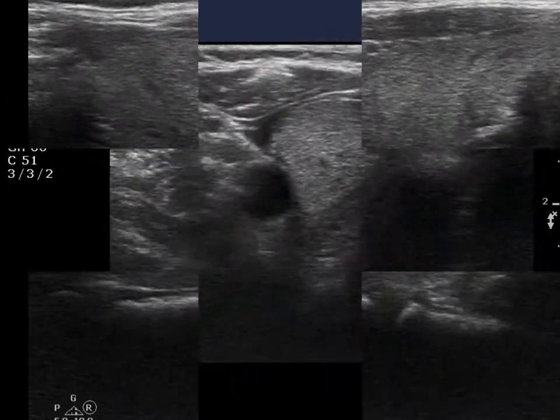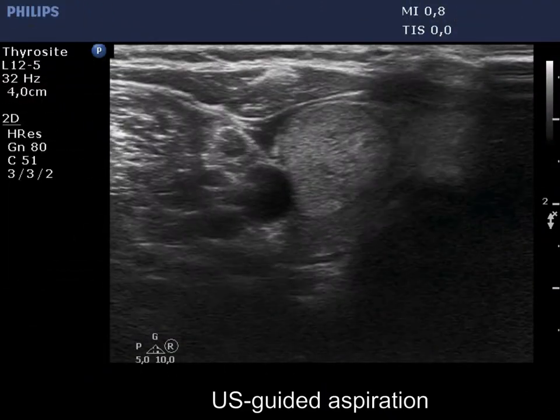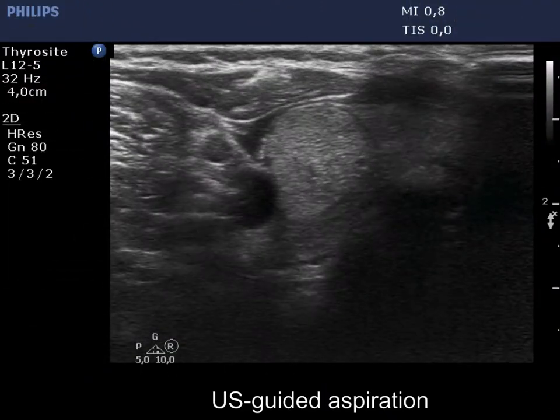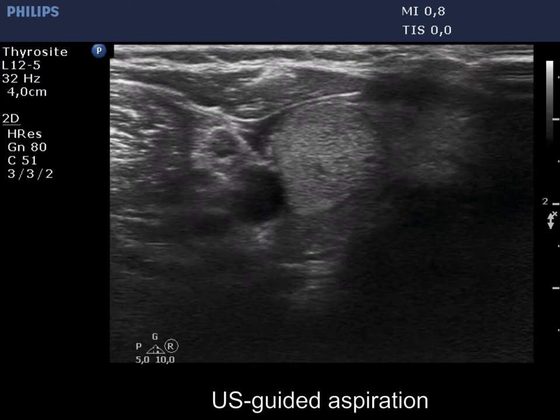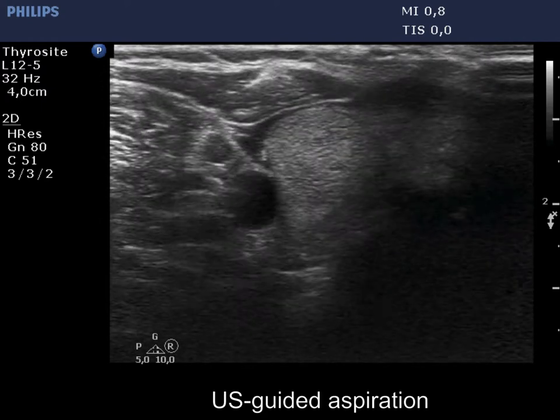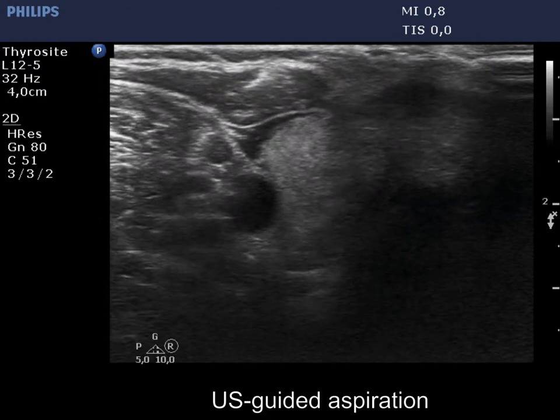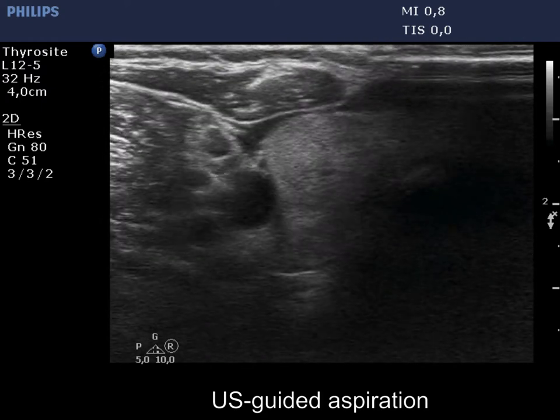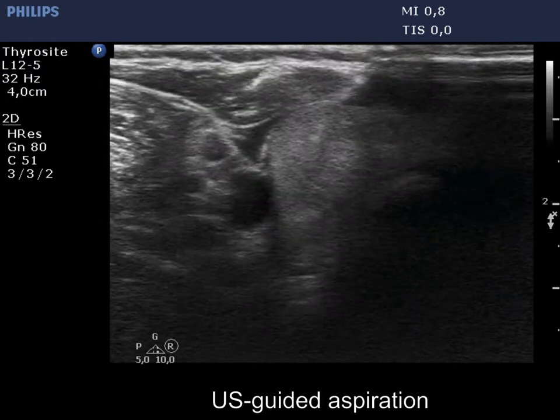On ultrasound-guided aspiration, first we locate the nodule in the center of the field of vision. The tip of the needle is easy to identify.